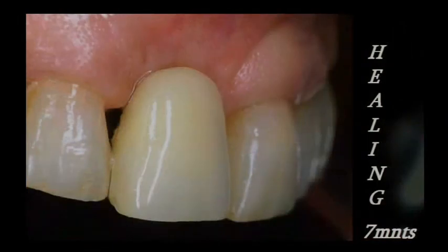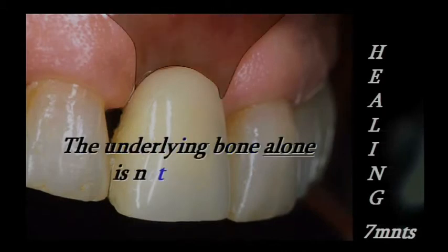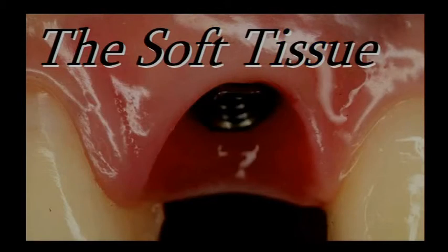7 months down the road, you can see there is a thin biotype. And we heard this already before. Having just the underlying bone, even if that's enough to cover the implant, it's not enough. We also need the thick biotype. The soft tissue envelope has to be adequate. And so soft tissue component is really important, as the underlying bone is important.